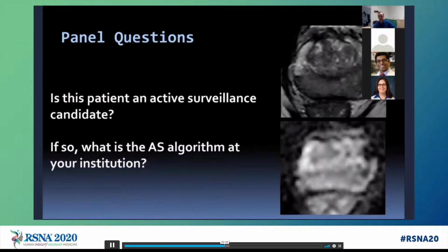So I guess the point around this was whenever we do an MR in this context where we have that history, one question we're asking, as I said with the previous cases, is what's the staging of the gland? So particularly the T stage of the gland. And really the secondary question we have to then ask and answer is, given the fact that we've had a systematic biopsy, and if we think back to case 2, we know we can miss significant disease.